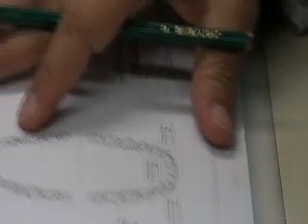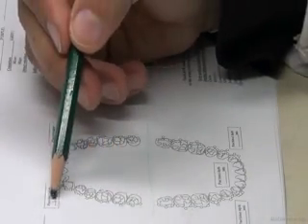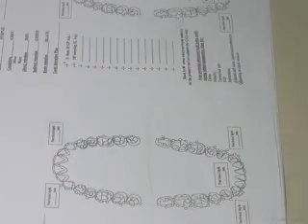Other than clinical examination, we also examine occlusion on abutment teeth because we want to see if there are tight occlusion contacts. We could see it in the patient's mouth, or when we articulate the upper and lower cast, we can see them on the articulator. The idea is, wherever we have tight occlusion contacts, sometimes we prefer not to rest on that area, not to put a rest on it. So these are the findings. The chart also includes other findings, not to forget them. Always take the functional depth. That's very important.